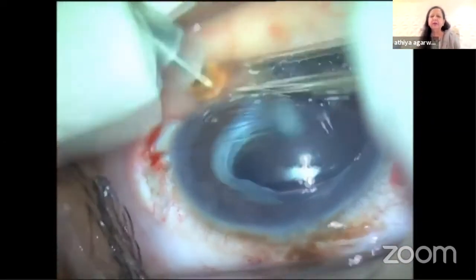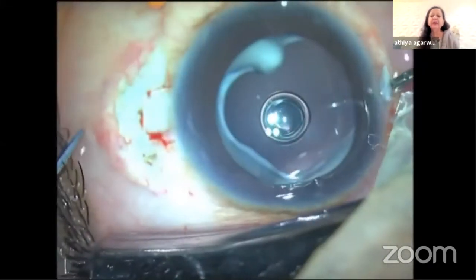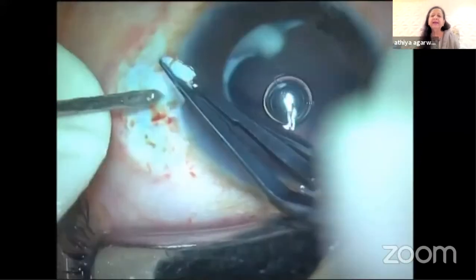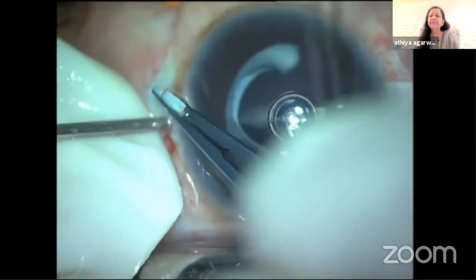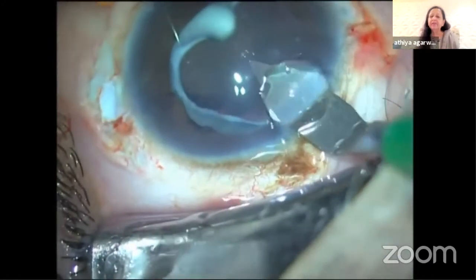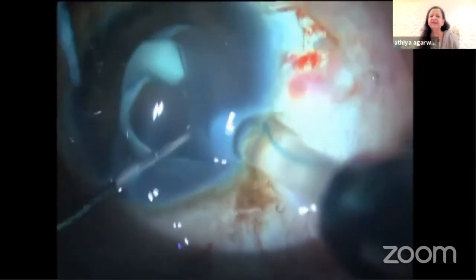The name scaffold was given by Dr. Amar. Here you can see me putting a trocar cannula just behind the limbus and then creating scleral flaps 180 degrees apart using the epsilon flap marker started by Ashwin. I have no financial interest, as I said in the beginning.